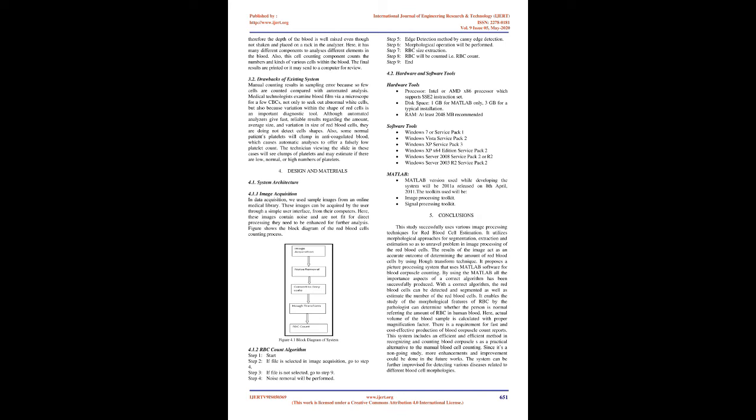Here, it has many different components to analyze different elements in the blood. Also, this cell counting component counts the numbers and kinds of various cells within the blood. The final results are printed, or it may be sent to a computer for review.